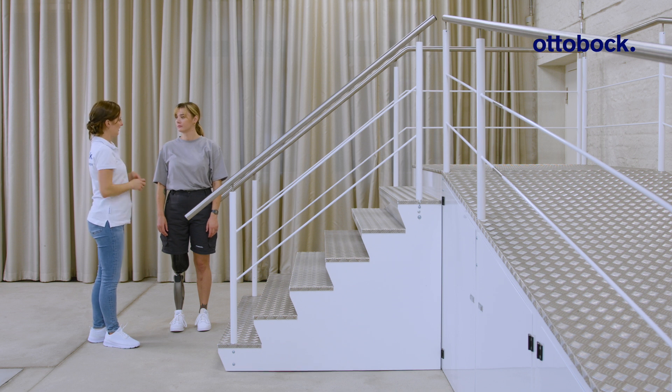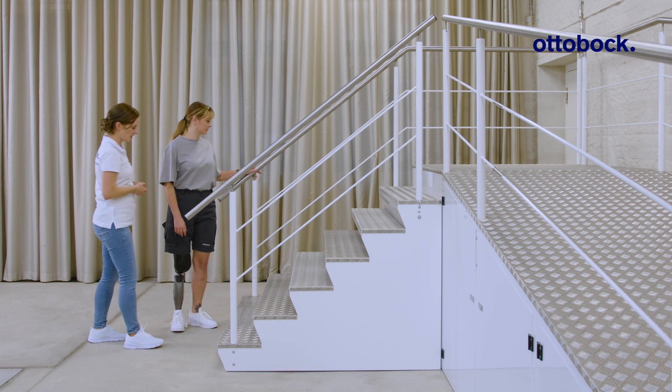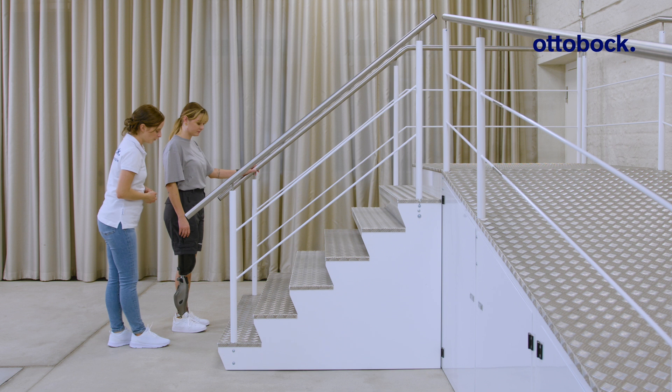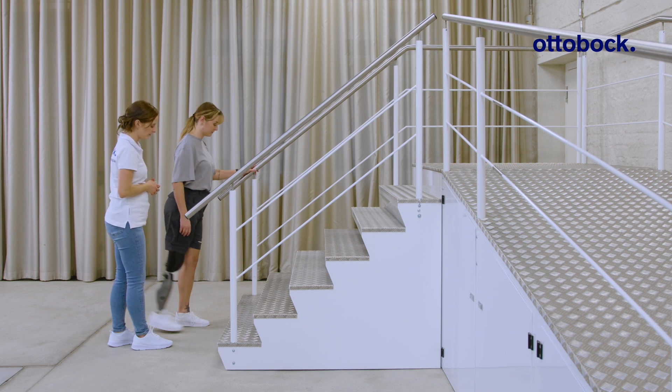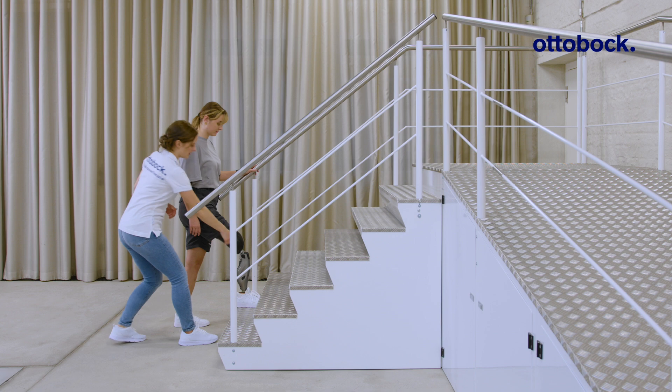The fundamental exercises for stairs and obstacle function are put into practice: triggering the function, foot placement, and finally stepping up.